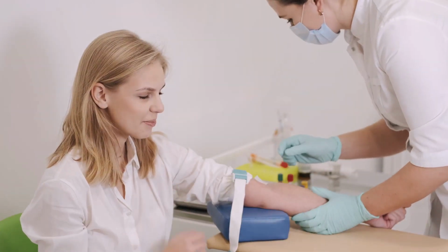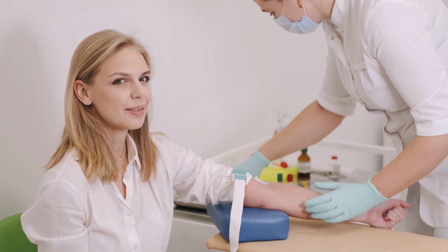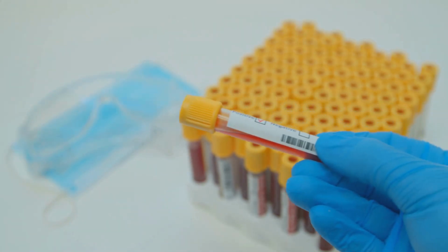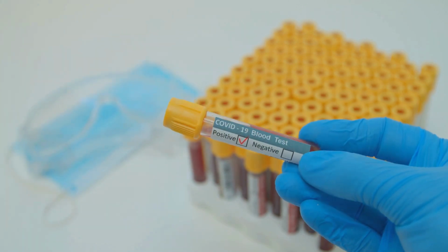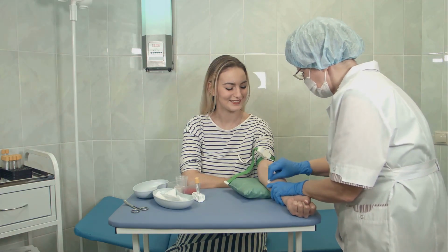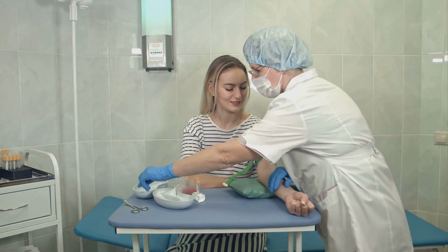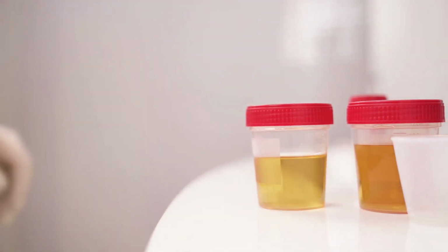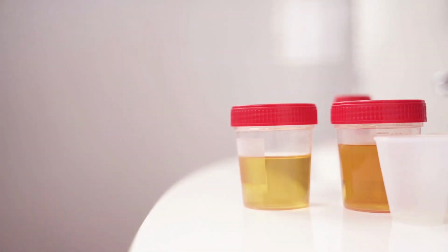The standard also addresses sample collection methods, providing detailed guidelines for various types of samples. Different sample types require specific collection techniques tailored to the nature of the sample and the tests to be performed. For example, blood collection might involve venipuncture or capillary puncture, each with its own set of protocols to ensure sample integrity, while urine collection might require a clean catch midstream method to avoid contamination and ensure accurate results.